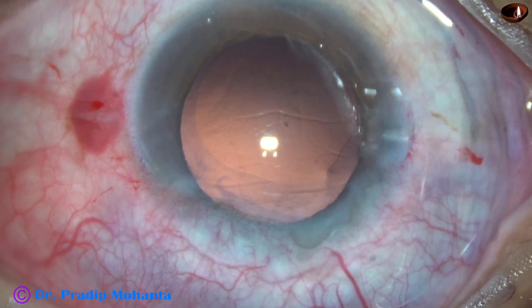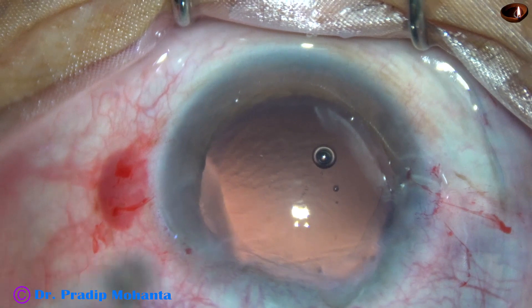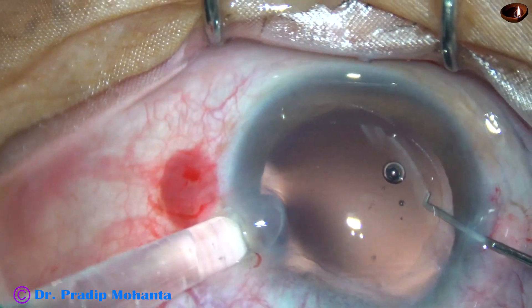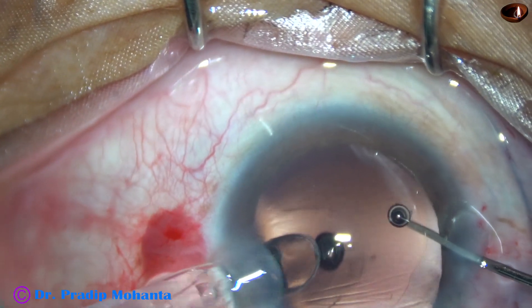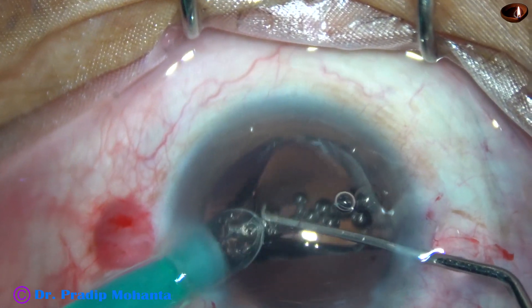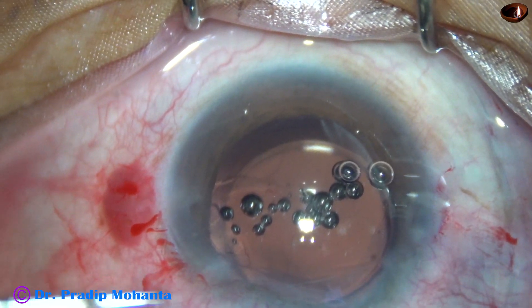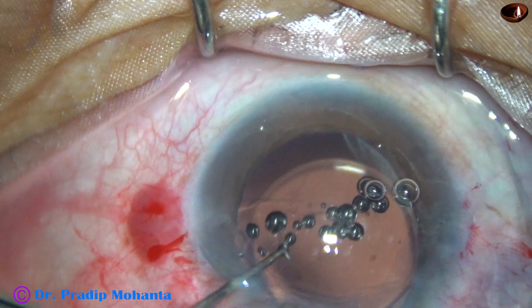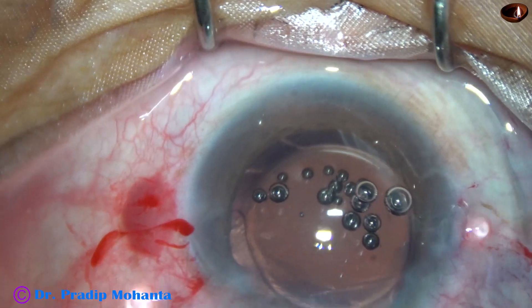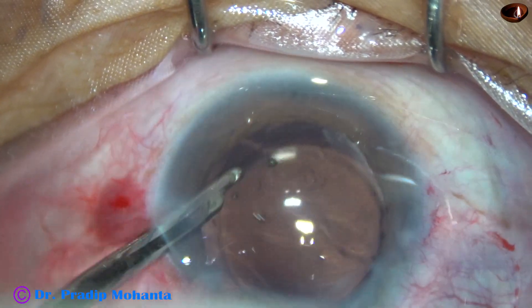In this case I didn't try hydro-implantation because it appeared a bit cumbersome. So I have filled the capsular bag and the anterior chamber with 2% HPMC. I have enlarged the main incision a bit. Now I am going to inject the lens. Injection of the lens is being done by the non-dominant left hand, and the intraocular lens goes into the capsular bag. I am going to check whether it is in the capsular bag — dial the lens, and at the areas of the haptics, if I can hook the rhexis margin, it means the IOL is in the capsular bag.